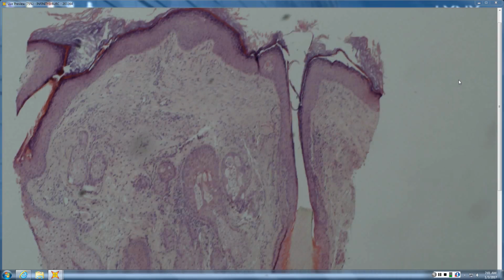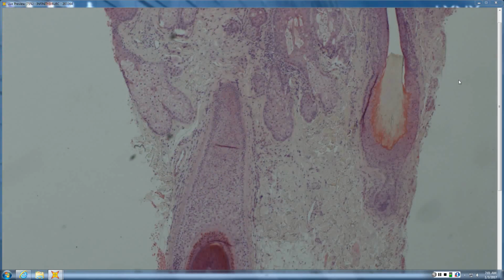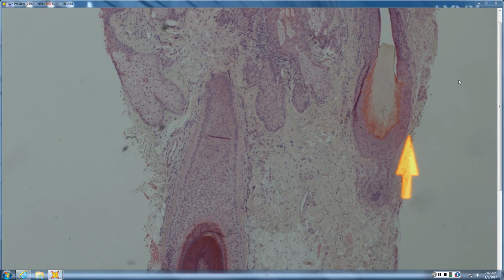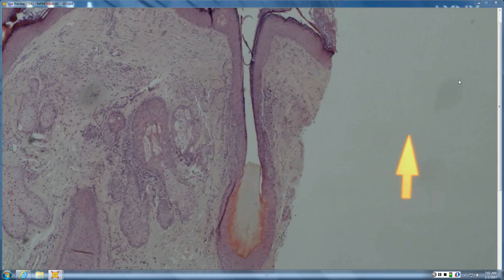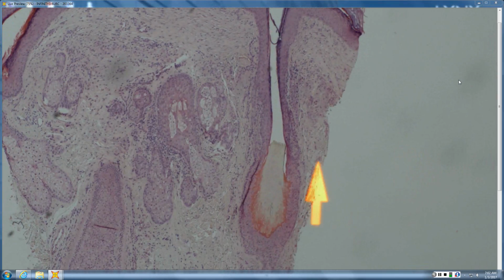And then up here is where you see that flamethrower-like appearance of the telogen hair. And so these anagen hairs start to undergo apoptosis and get either pushed up or pulled up, however they start going up. There's difference of opinion on how that happens. And then you get the fibrous streamer below, and as that hair shaft is starting to turn into that club hair that ends up falling out, you see this flamethrower-like appearance, and that is a great example of telogen hair.